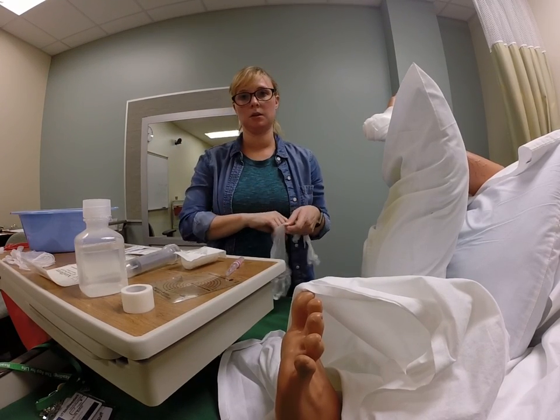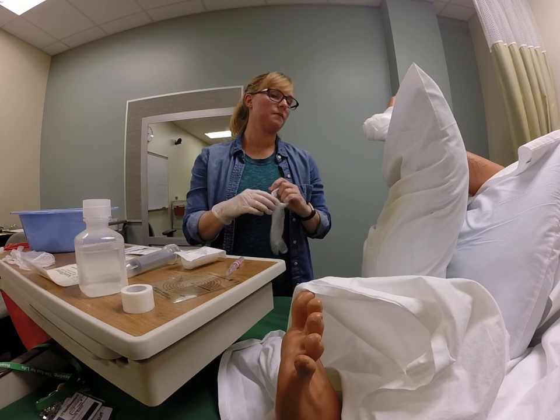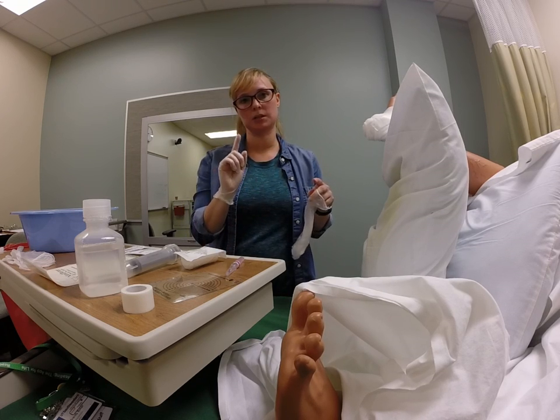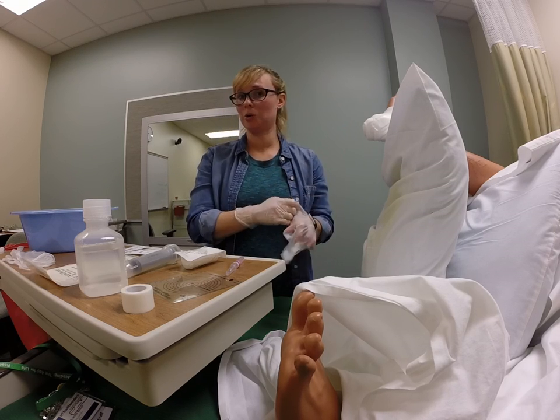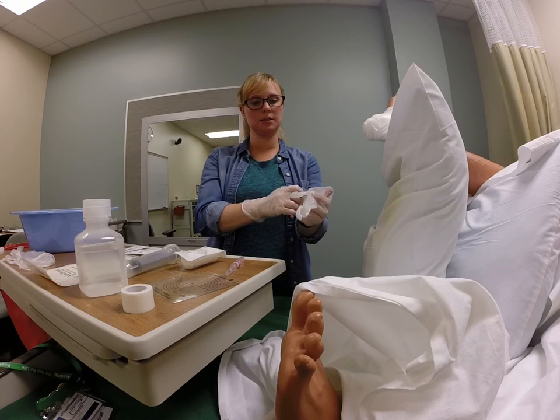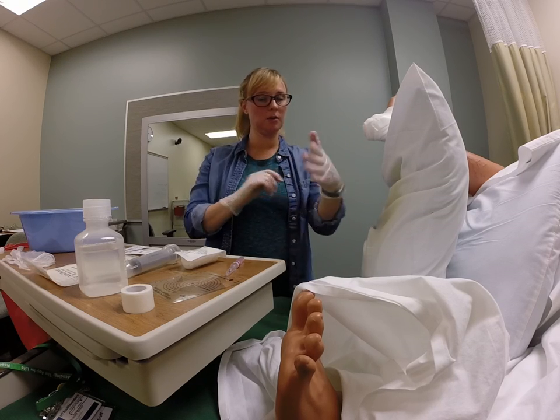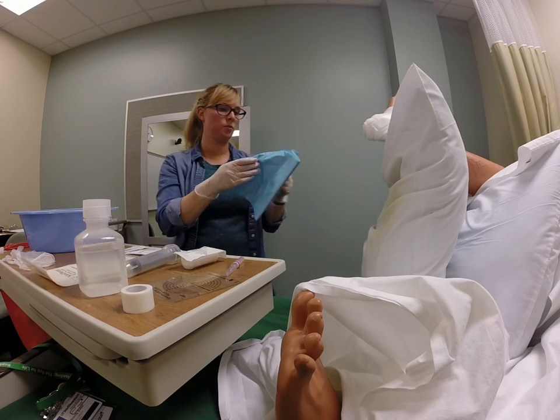Alright, so now we're going to do the heel wound, the third of the complex wounds. We have the stomach, which we've shown, the thigh, just like the stomach except one 4x4 gauze packing, and then this is the heel. I personally think the heel is the easiest, but students don't like it when they get the heel because they usually don't practice it.